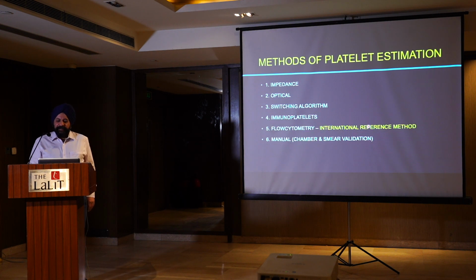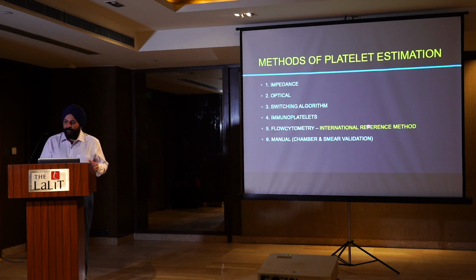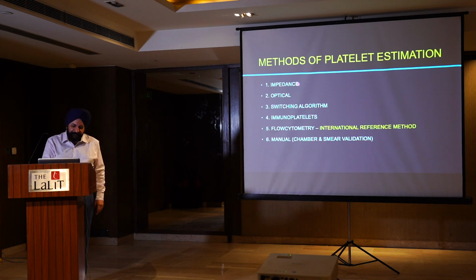So the methods of platelet estimation, I think for those of us who fought the dengue case against Mr. Kejriwal, we all know it by heart. The most common method is the impedance method, which most of us are using. But unfortunately in dengue this doesn't work because there are giant platelets, platelet clumps, and fragmented RBCs, and because this is primarily dependent on cell size, this fails us in dengue.